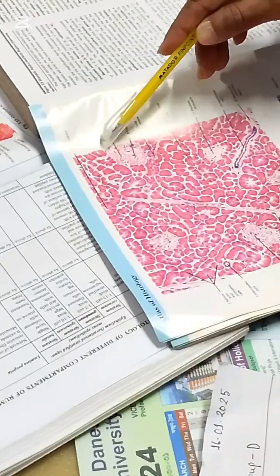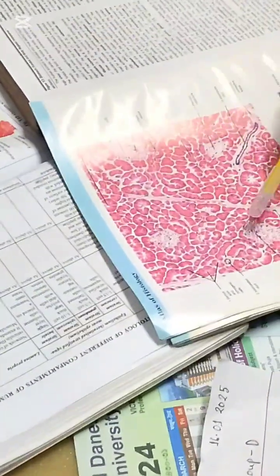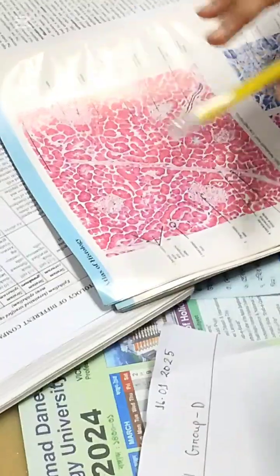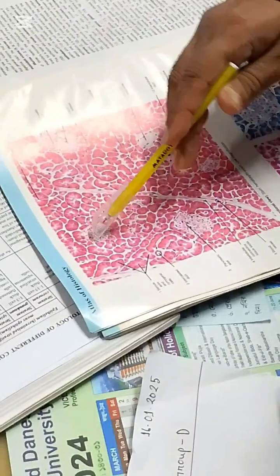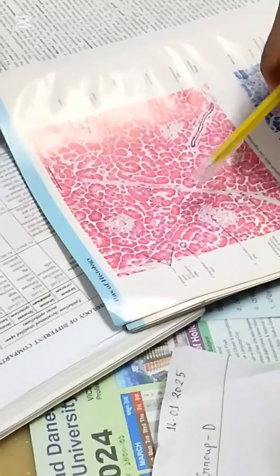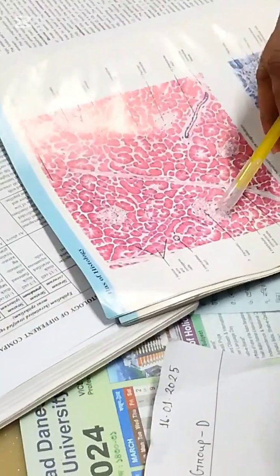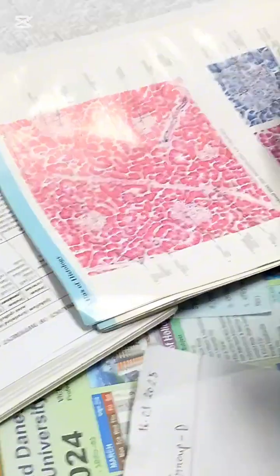These are islets of Langerhans, scattered throughout the pancreas. Islets of Langerhans consist of three types of cells: alpha, beta, and delta. Okay, here you can see.